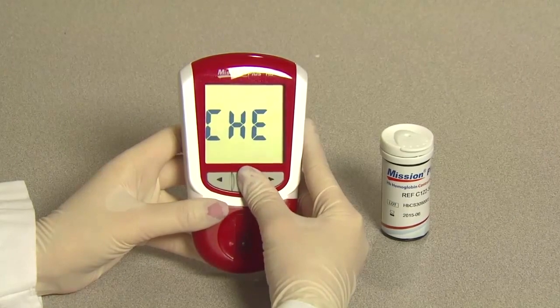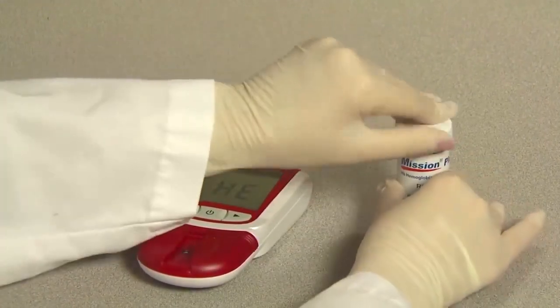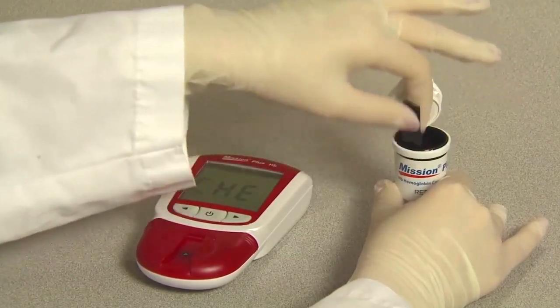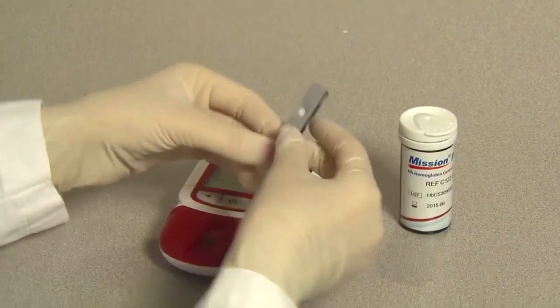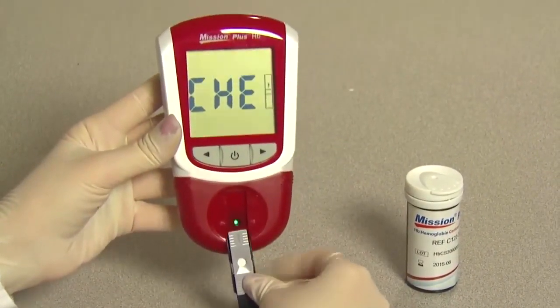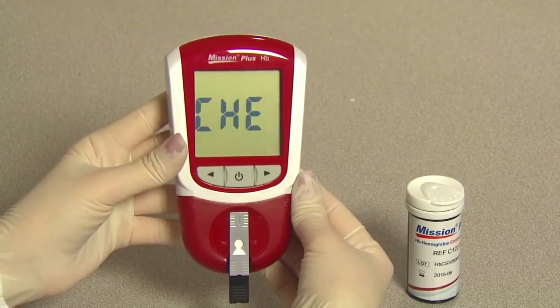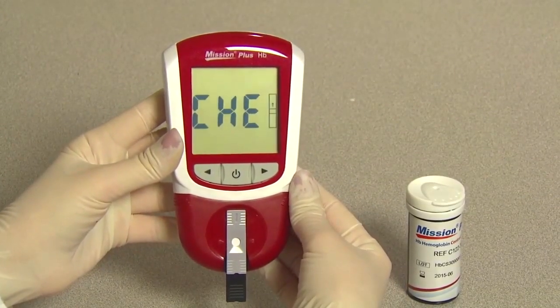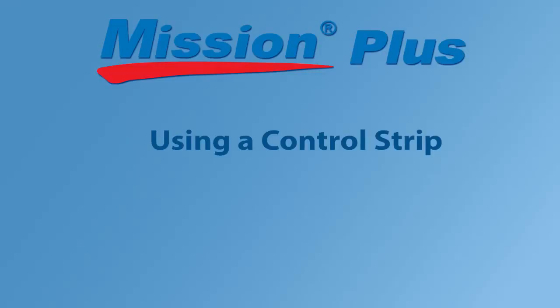Press the power button to enter this mode. The meter will flash the test device or strip symbol. Open the canister and remove a control device. Make sure to recap the canister tightly. Firmly insert the control device into the device channel in the same direction as the arrows indicate. Ensure that the control device is inserted all the way to the end of the device channel.